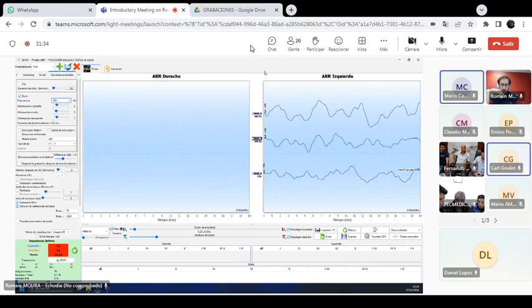That's correct. Let me share with you. There's a part in the technical requirement where they ask specifically for the output amplitude range for air conduction, bone conduction, and there was one more conduction there. So we put the maximum capacity that the unit has, just to show that the equipment can functionally do it.